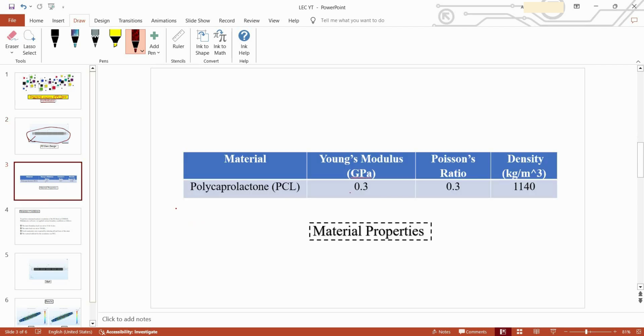And for material we have used polycaprolactone. The material properties of polycaprolactone are: Young's modulus is 0.3 GPa, Poisson ratio is 0.3, and density is 1140 kg per meter cube.